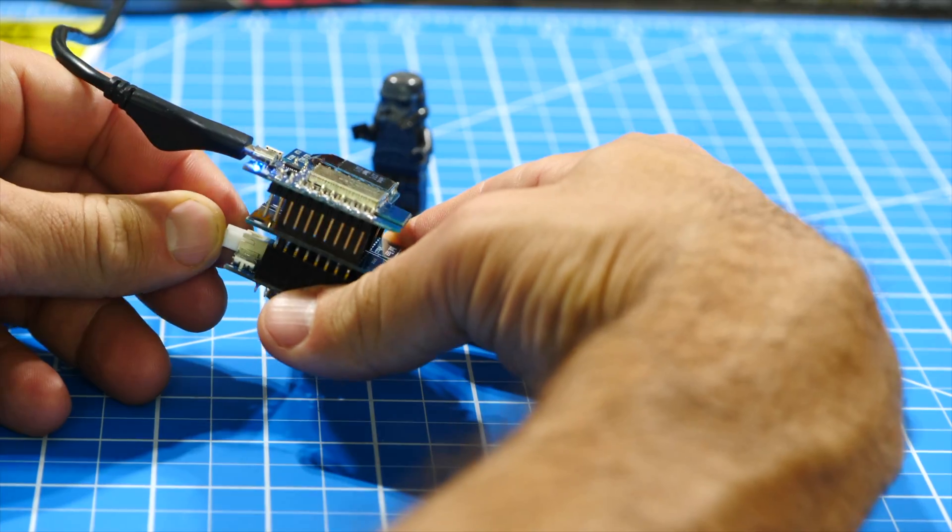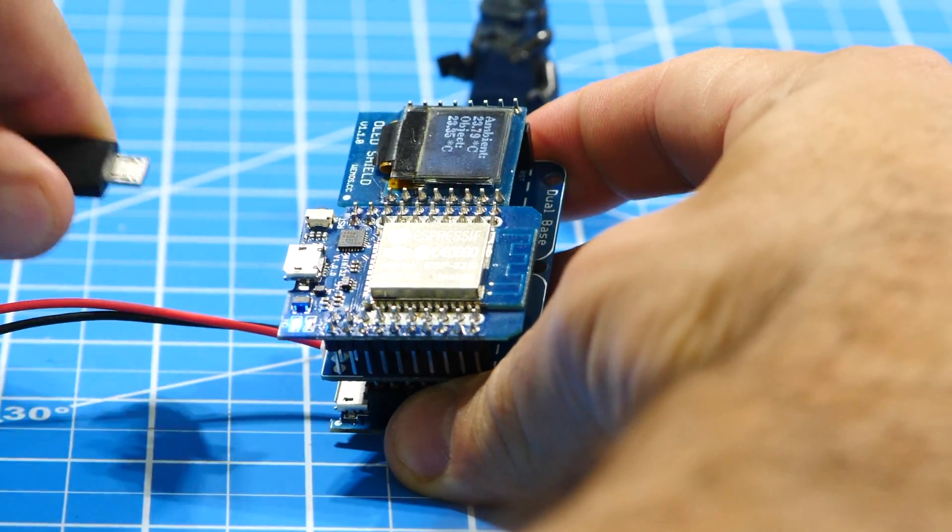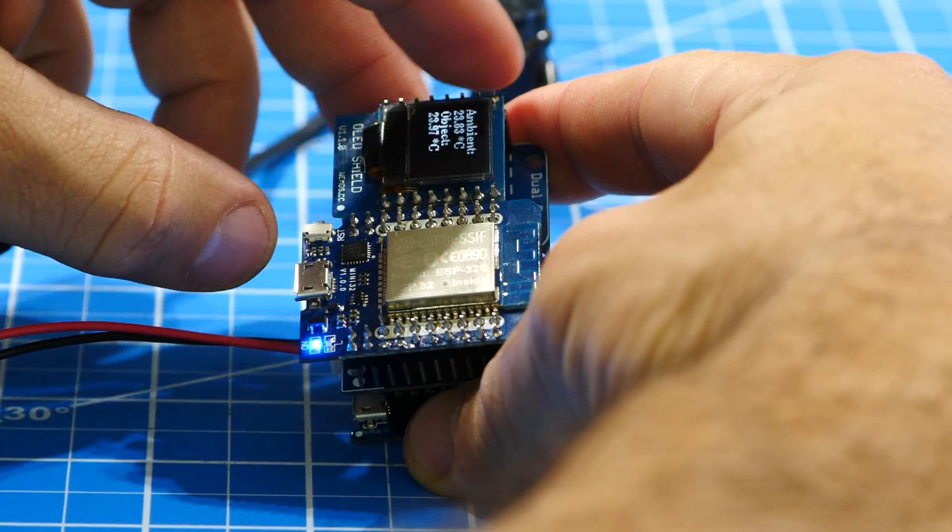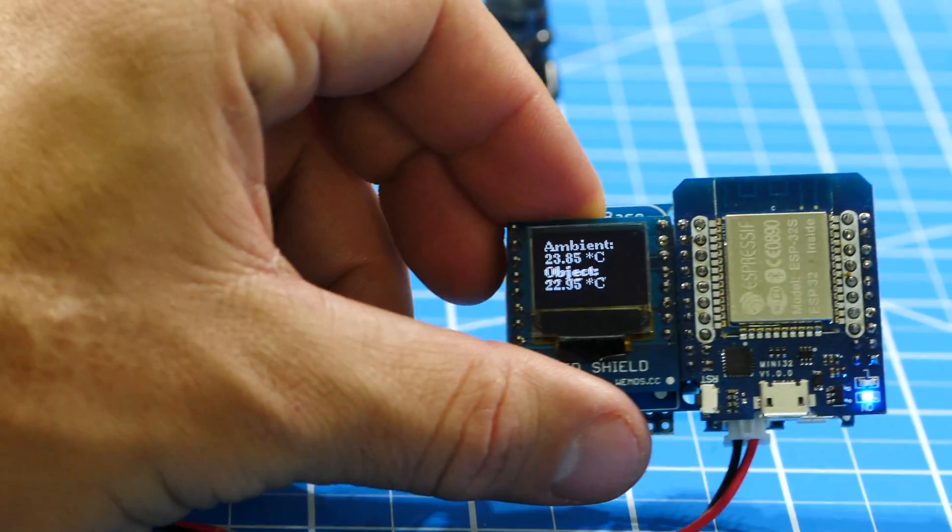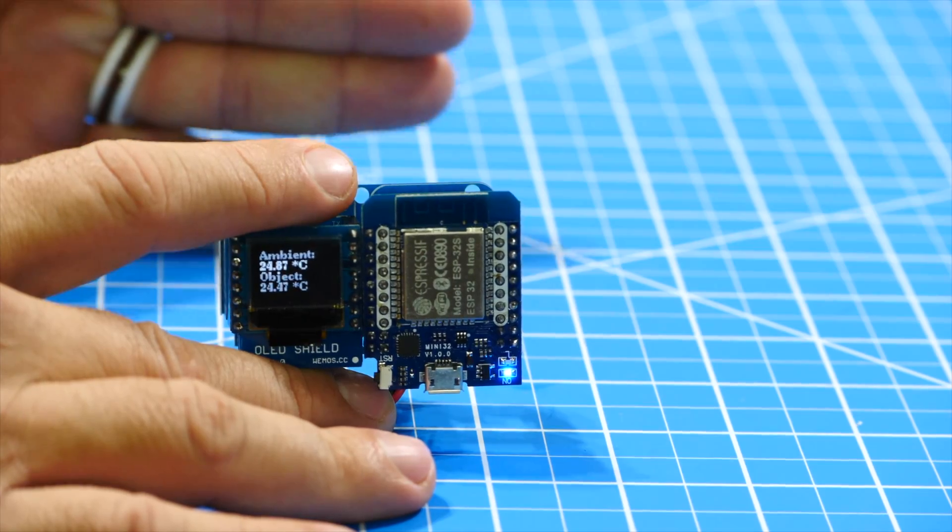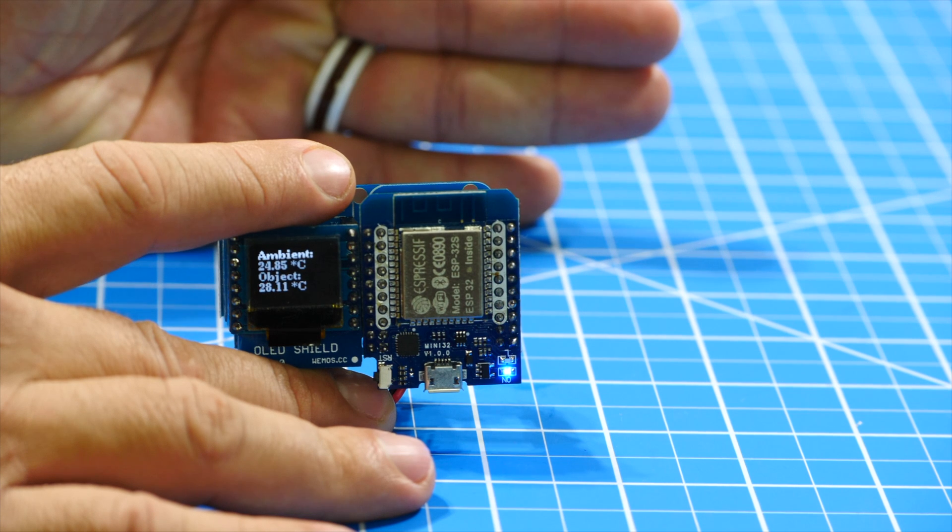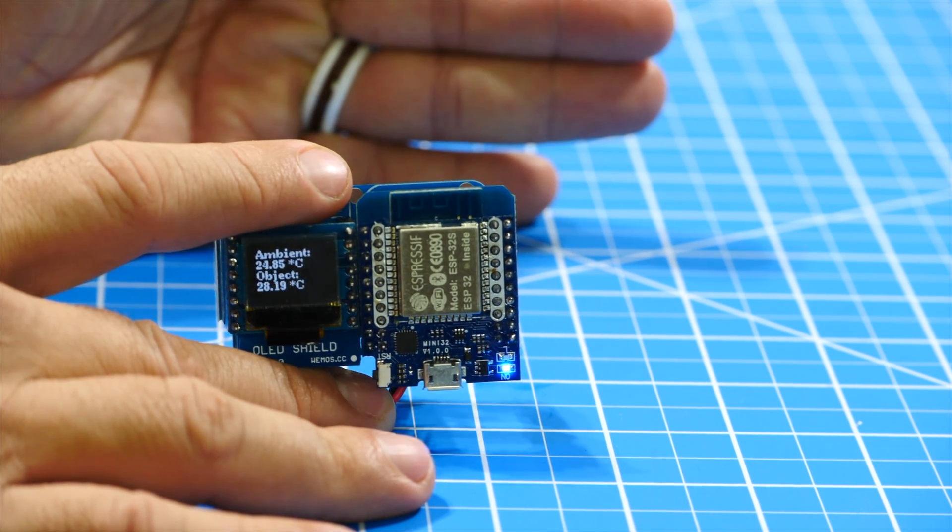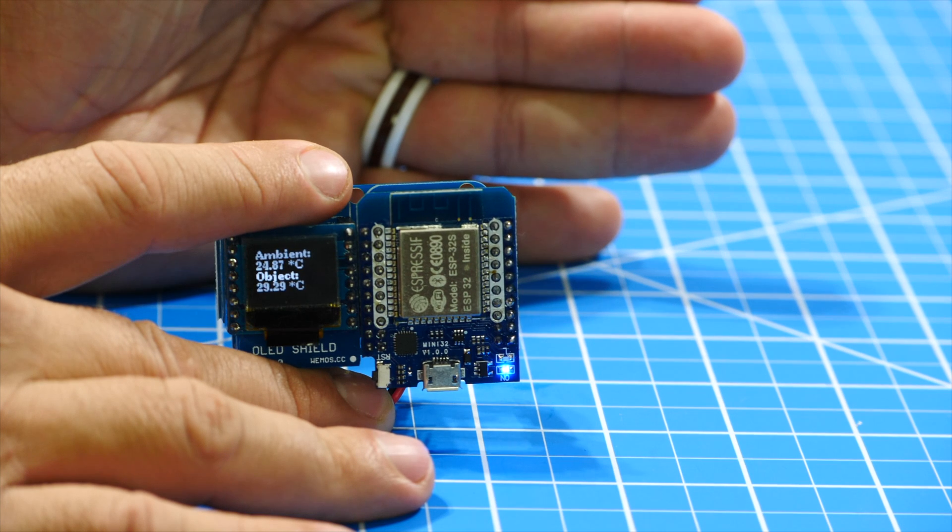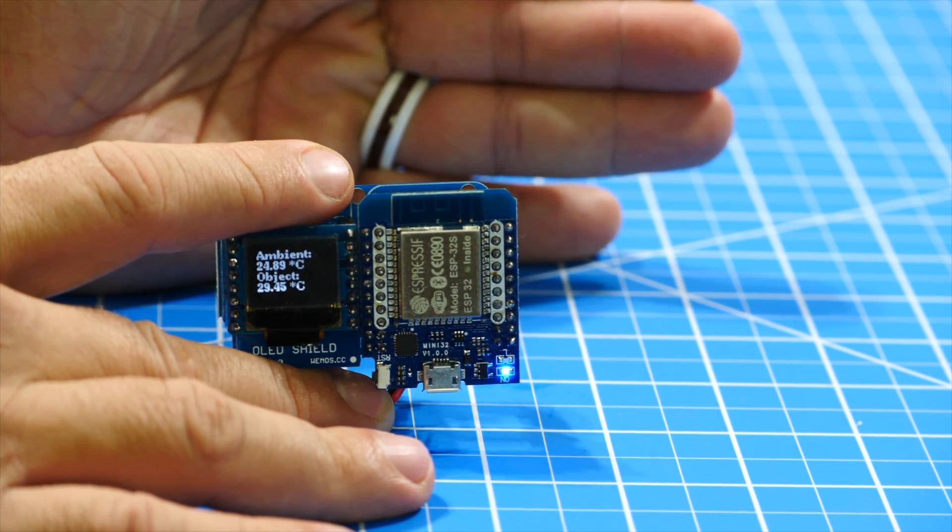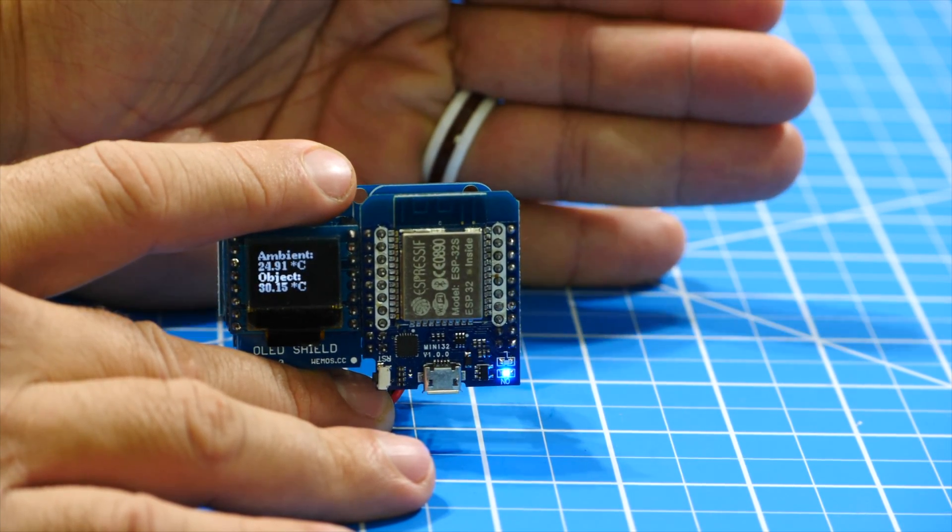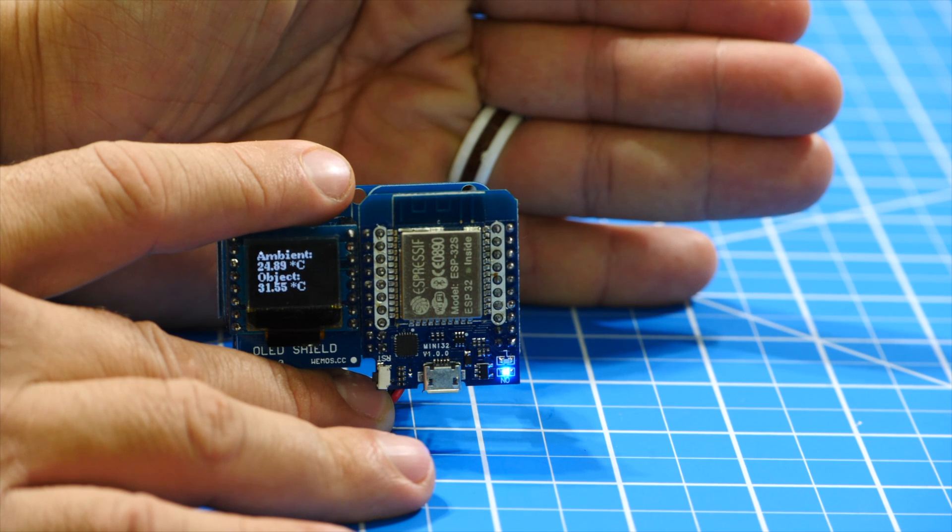I can then go ahead and connect the battery, unplug the ESP32 from the USB connection and use the device as a portable contactless thermometer. If I try to measure my body temperature, it gets pretty close. Notice that, unfortunately, the range of the sensor is not that great. So even though it's contactless, I need to come up pretty close to it.